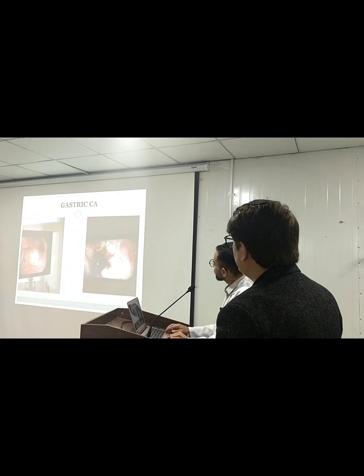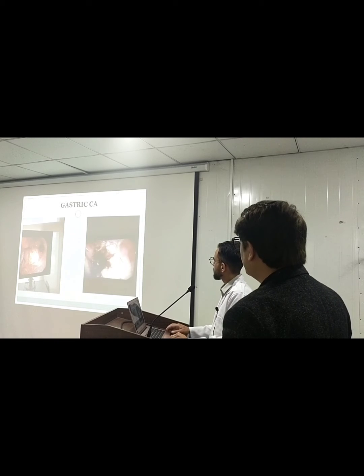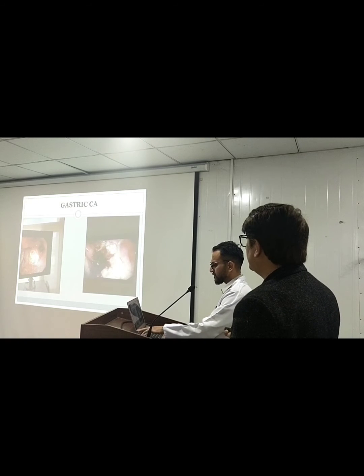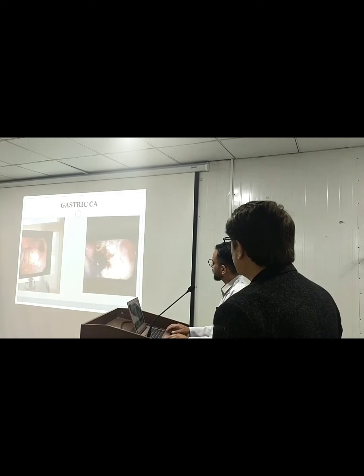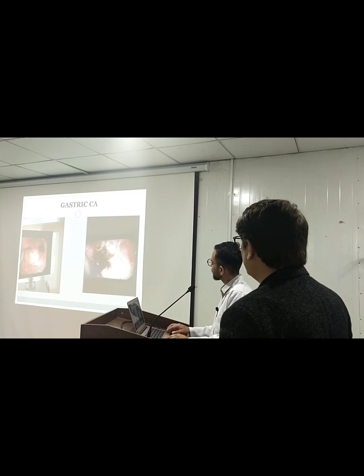Gastric carcinoma. We have a lot of gastric CA patients here in GB. We are well known for gastric CA. It's very common. For diagnostic and therapeutic purposes, we usually do endoscopies of patients having symptoms. So gastric CA is very common and very frequent nowadays. So this is the cancer.